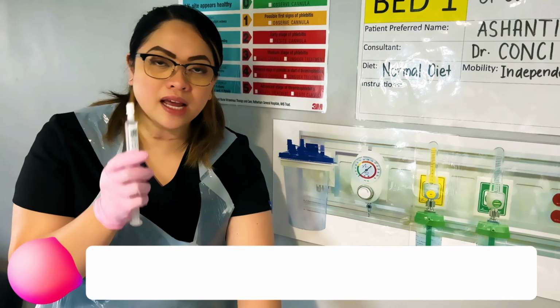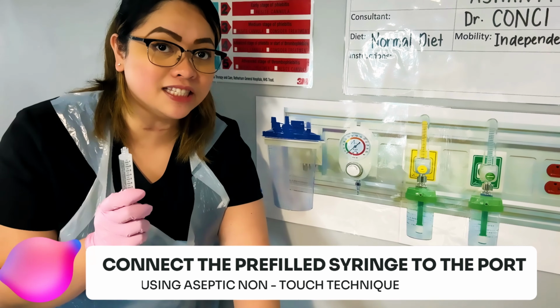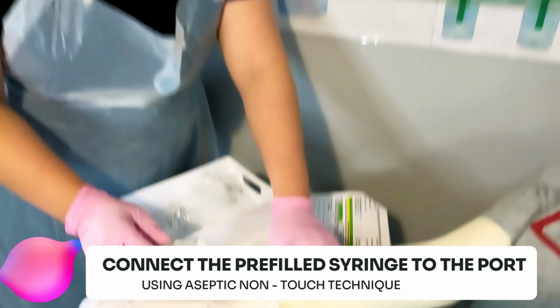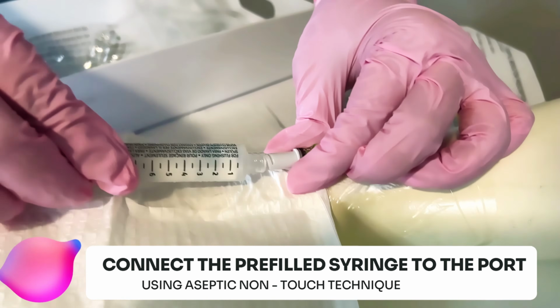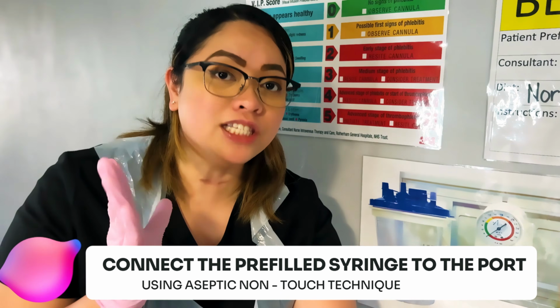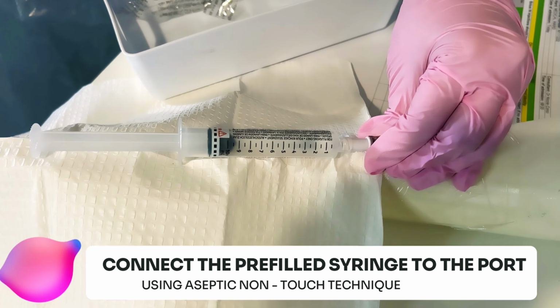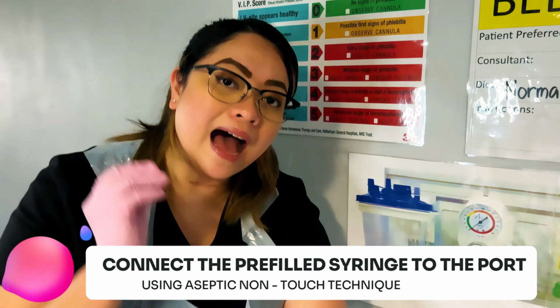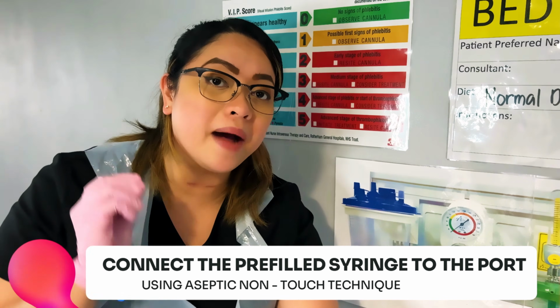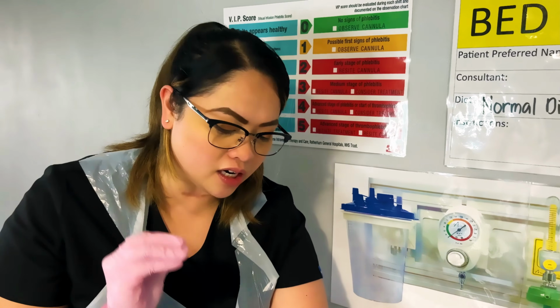Now, I'm going to connect the pre-filled syringe to the port using an aseptic non-touch technique. As you can see, right here, I am not going to remove my hand. Once I put this hand here, I'm not going to remove that one.